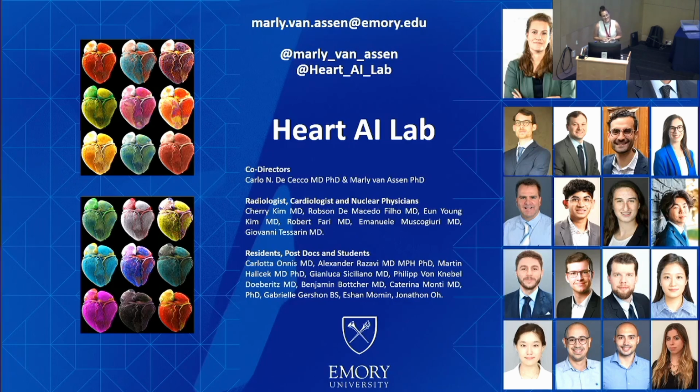Thank you so much. So how to convert from CT, which has lots of slices, to RGB? Okay, so for CT, it works differently because in CT, you have all your window settings that you want to take into account. We do a lot of 3D volume, so you give the whole volume in, to also add the whole information about your window settings. So you have all of those intensities normalized.